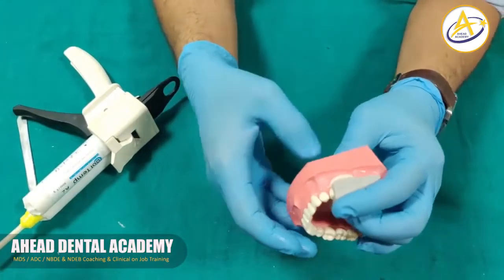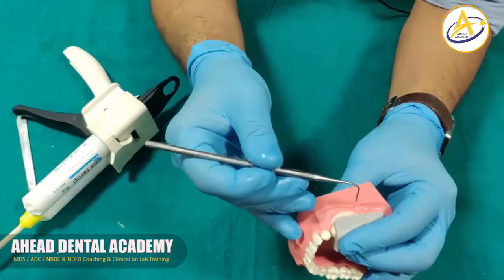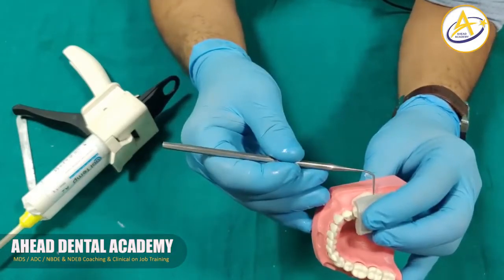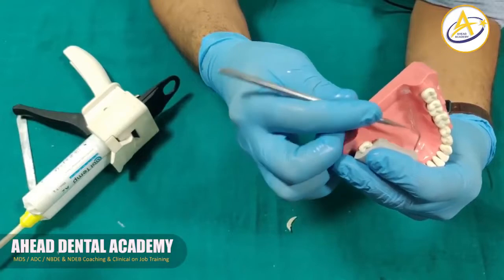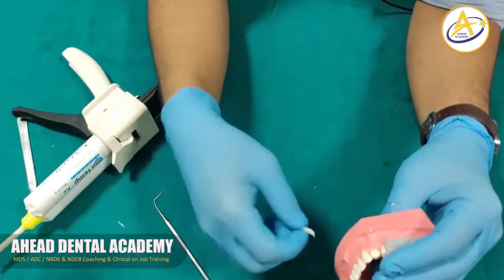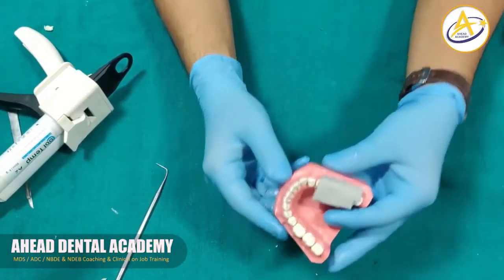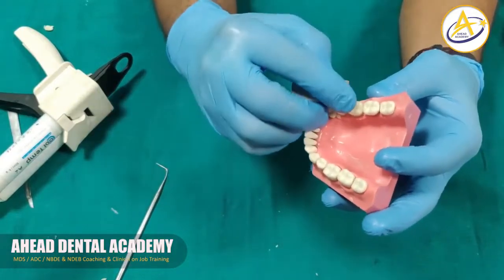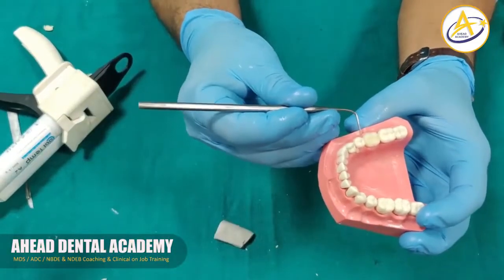After it starts setting, we remove any additional material that has flown below the index, and let the material set. After the initial set has happened, we remove the index, and this is the temporary tooth that is being formed.